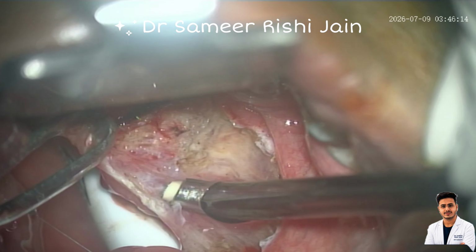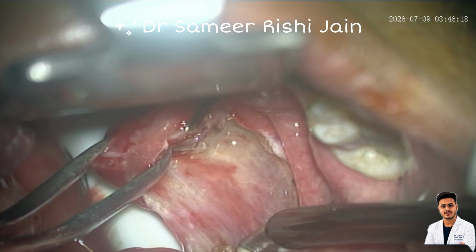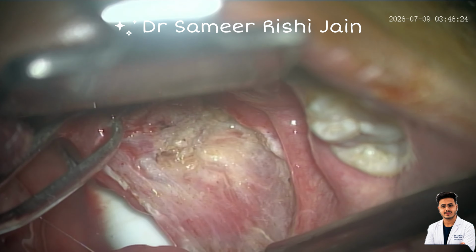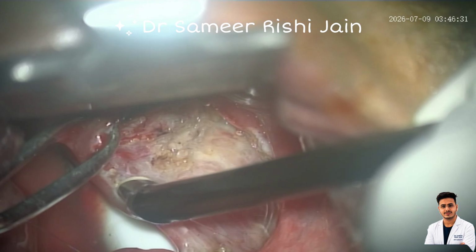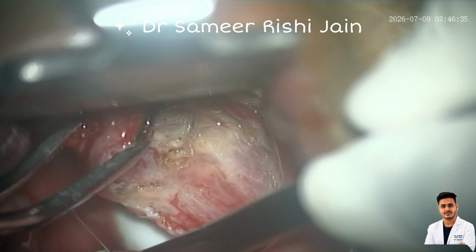The oozing which we are seeing is the capillary bleeding or the venous bleeding, not the arterial bleed. And in the tonsillectomy procedure, this is considered a very minimal bleeding. Now we have to keep separating the tissue from the bed.